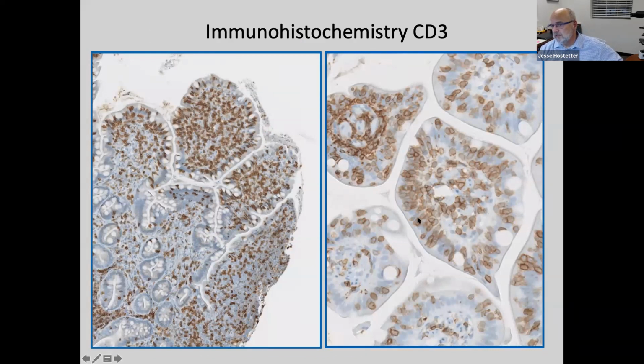Again, this is only villus tips, I realize, but you can really see the very dense infiltrate of CD3 positive cells and intraepithelial lymphocytes. I use the stain because there are not going to be B cells in there; they're going to be CD3, but it can really tell you how many there are. And then this image shows the villus lamina propria with lots and lots of these CD3 cells. So this is a finding that's consistent with low-grade lymphoma.